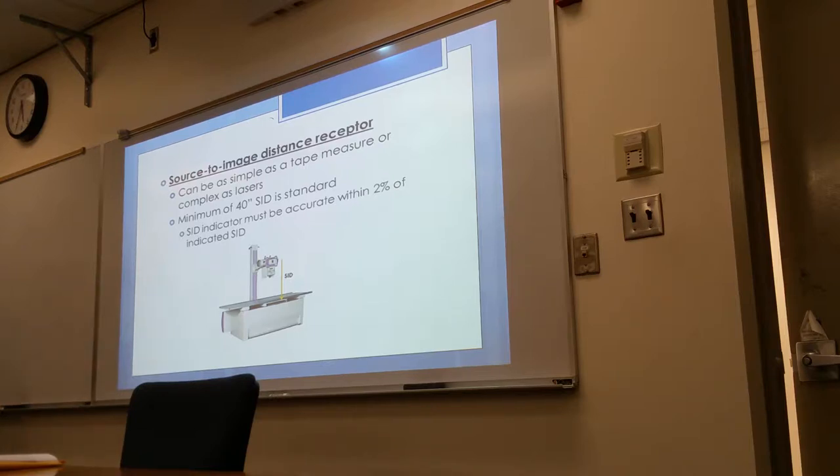Now, as we know, any changes in distance, doesn't that also change the intensity of the X-ray beam? Yes. Okay? Therefore, we got to make sure that the SID is accurate, because any changes in that will also change the intensity of the X-ray beam, which will also influence patient exposure.